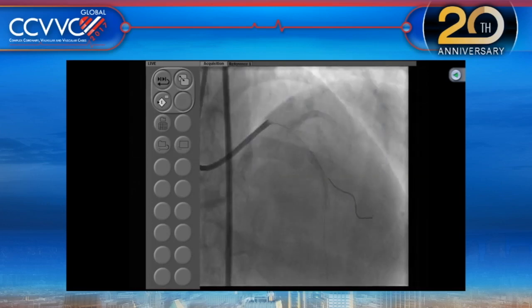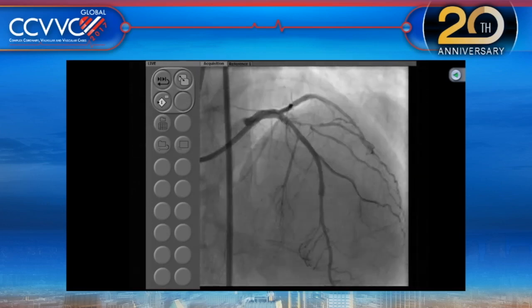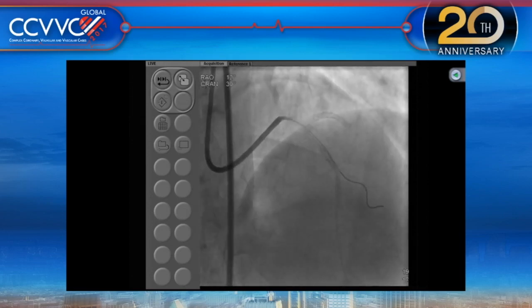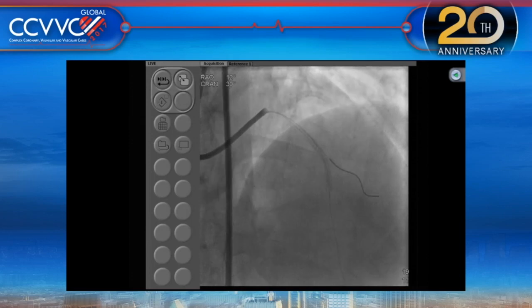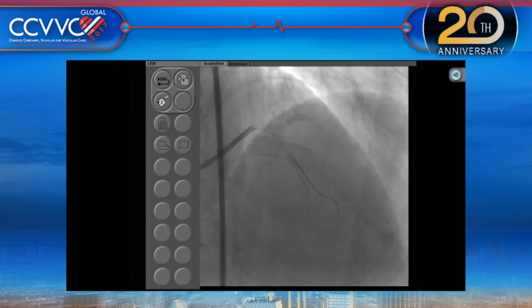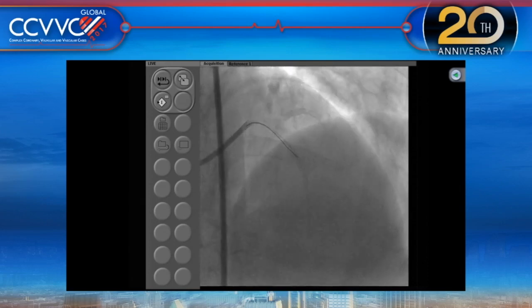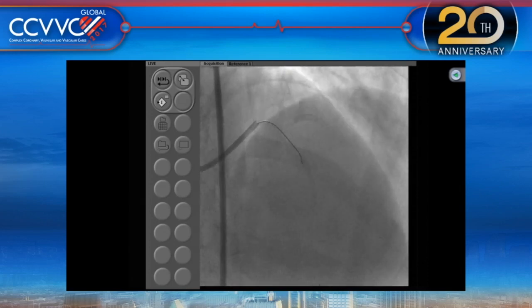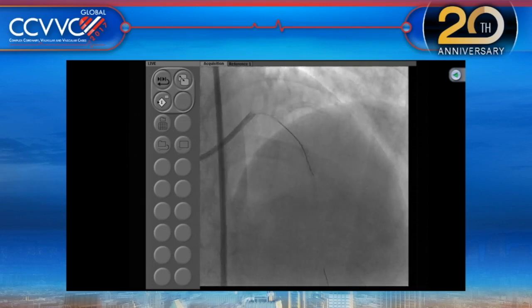And now look at this even. After that, this is a 3.0. The mid portion has still not dilated. Do you have a winging of the stent at the corners? Now we are going to take the wire out of the diagonal and rewire it. Pull back more.